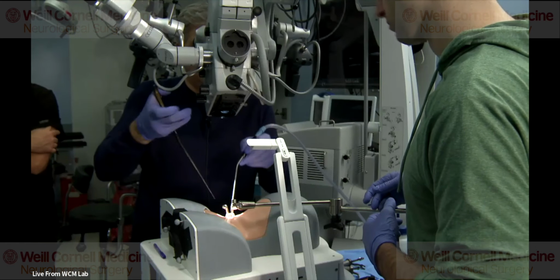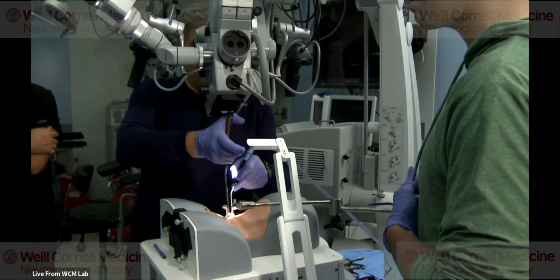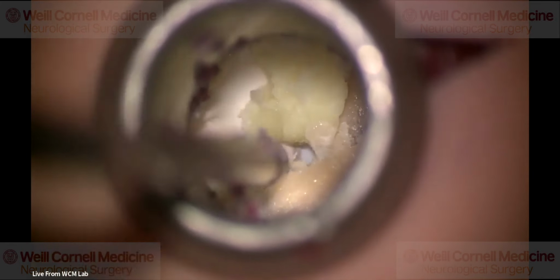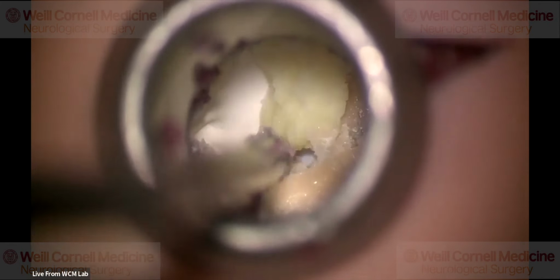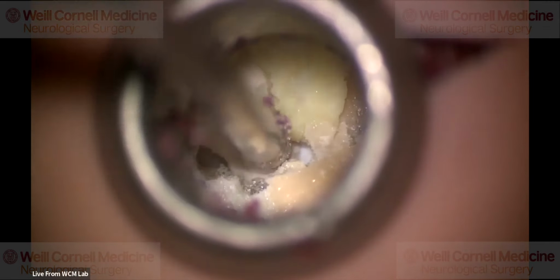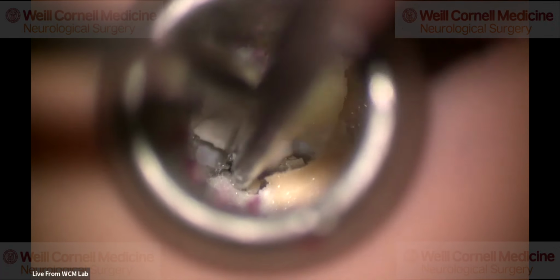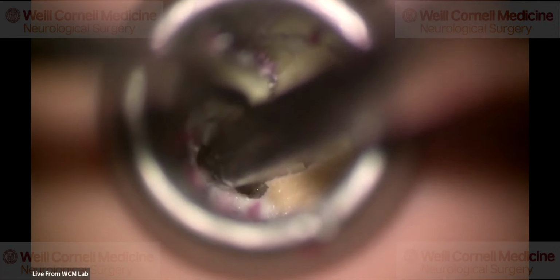Now in a real case, there would be an epidural venous plexus here, and I try not to touch that. Usually in a real case, you wouldn't see the exiting nerve root. You would see basically a lot of veins on top. I wouldn't touch those, because if you touch those, there's a fair amount of bleeding. So now I go lateral until I find the pedicle, and now I can hit the pedicle here.